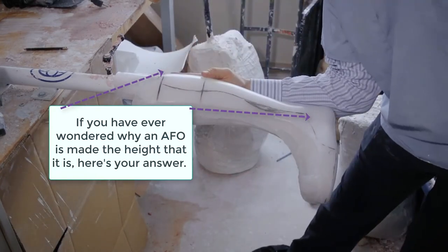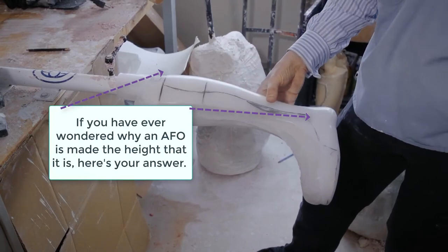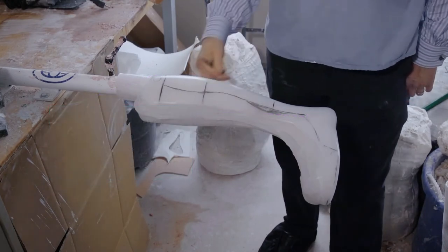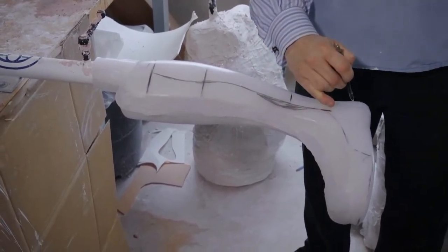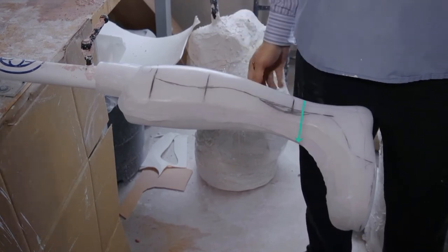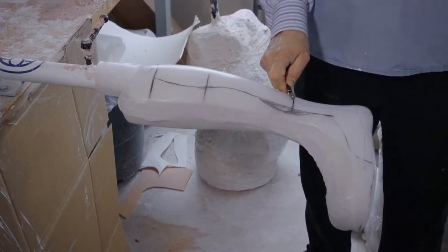So if we have a longer lever arm here, we can spread out the pressure on the leg. You could bring these AFOs way down here, and we'll say, just for argument's sake, that we made this AFO that height right there. You can imagine this distance right here trying to hold up this whole foot. That would hurt. That would press into that leg so much that that person would immediately stop wearing the AFO. So that's another reason why we don't make AFOs that height.